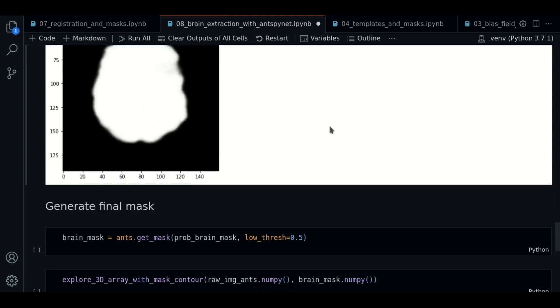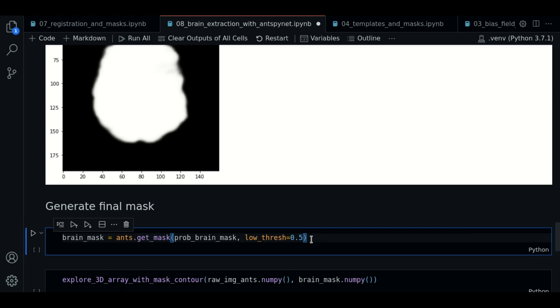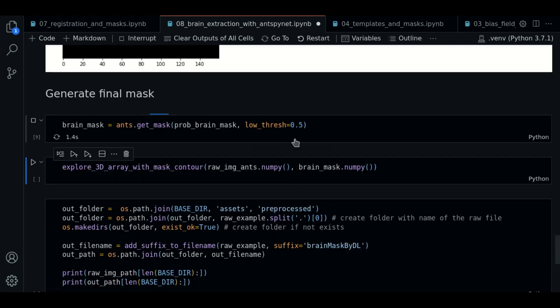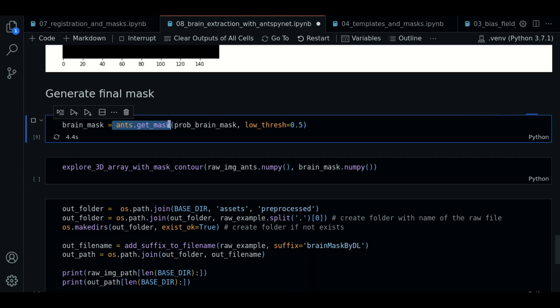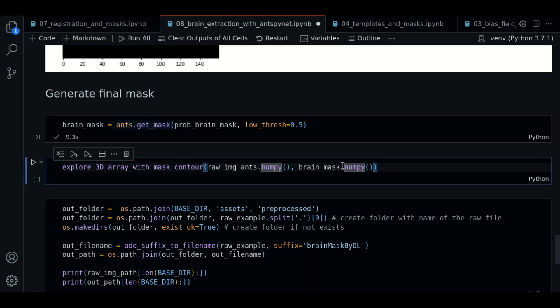Now we're going to generate the mask. We're going to use a function ANTS.getMask. We pass the probability image and the value of the threshold to be 0.5. This means every probability greater than 0.5 will be set to 1, and the rest will be 0. So this is the default value. If we execute, we're going to wait a few seconds. And here is where we actually get the brain mask.